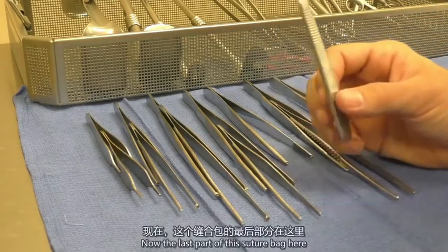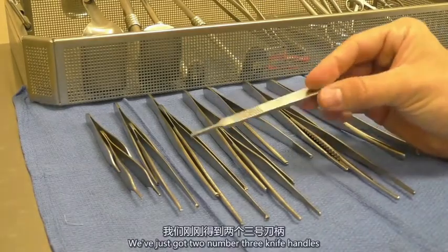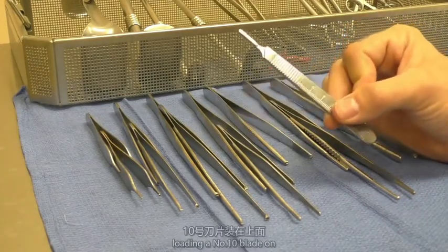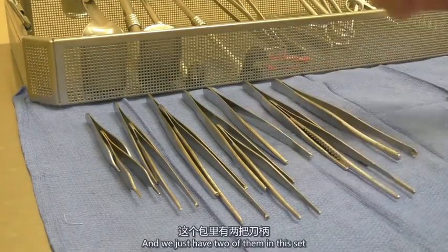Now the last part of this suture bag here is the knife handle. We've just got 2 number 3 knife handles. Again, this is like your main knife handle that you're going to be loading a number 10 blade on for them to use to make the incision. And we just have 2 of them in this set.